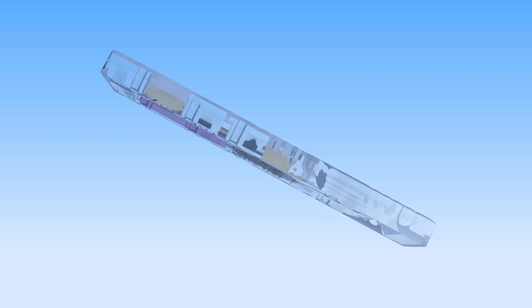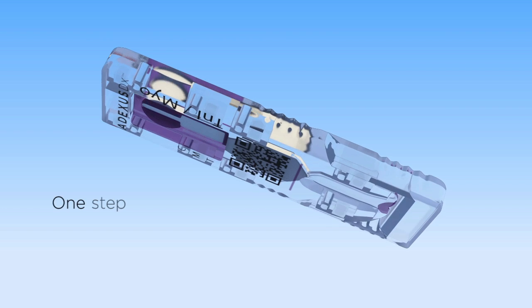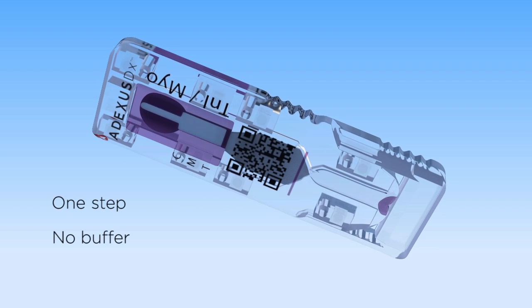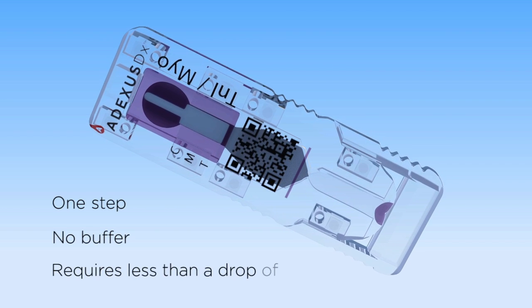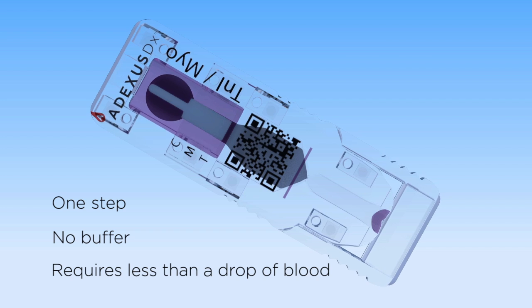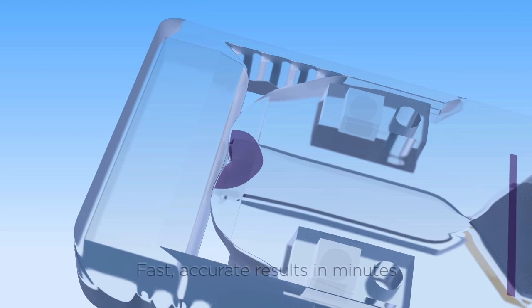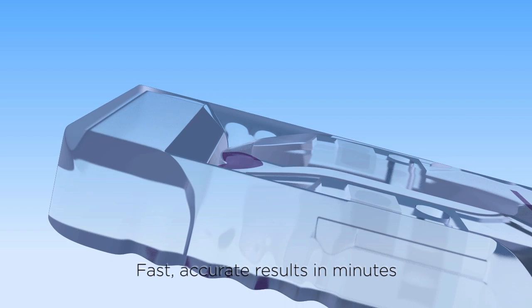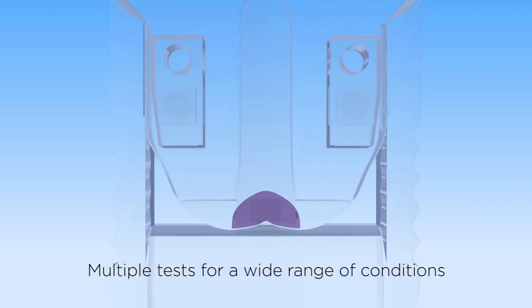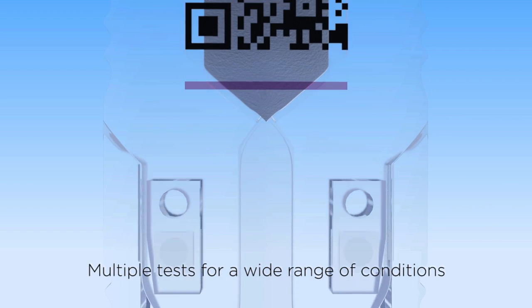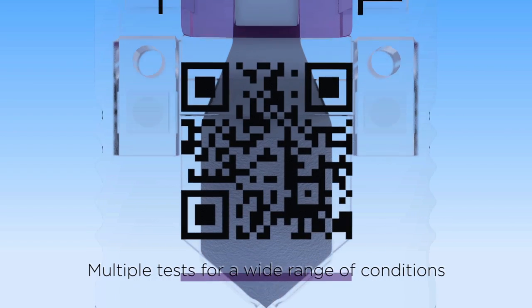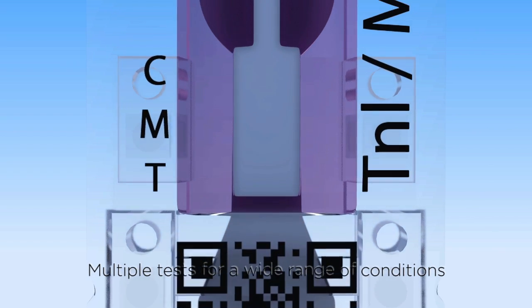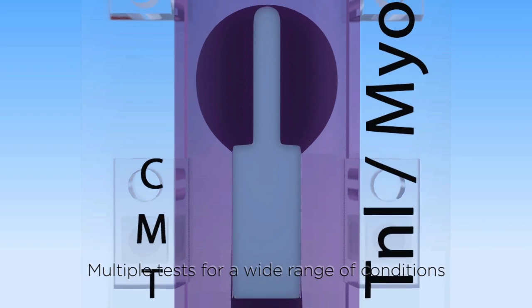Adexis DX is a true one-step test that requires no buffer and uses an ultra-small sample size, as little as 20 microliters. It delivers accurate results in minutes, not hours, not days. Due to its revolutionary design, Adexis DX makes lab-quality diagnostic testing possible on-site for a wide range of medical conditions and diseases.